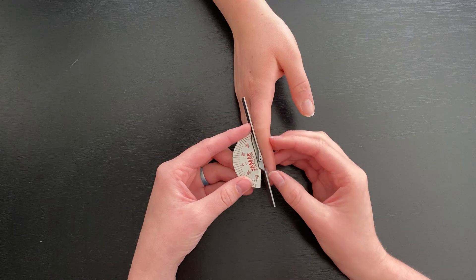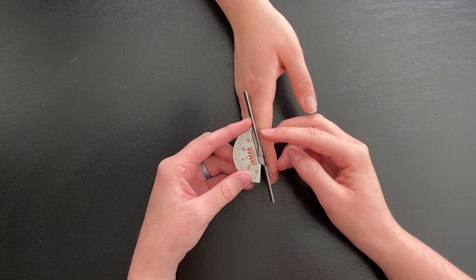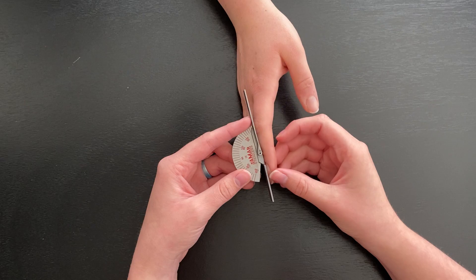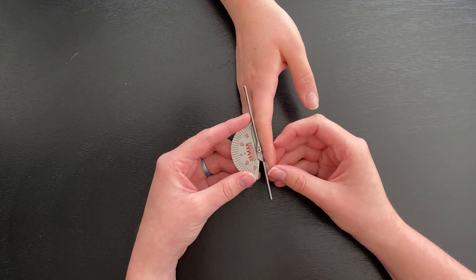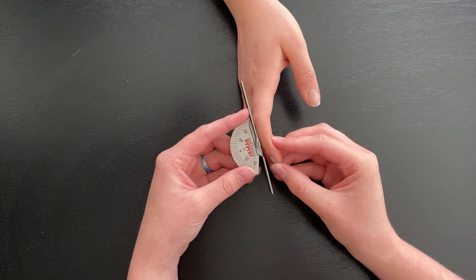So the stationary arm is going to be on the dorsal side midline to the proximal DIP joint and the movable arm will be on the dorsal side midline distal to the DIP joint.